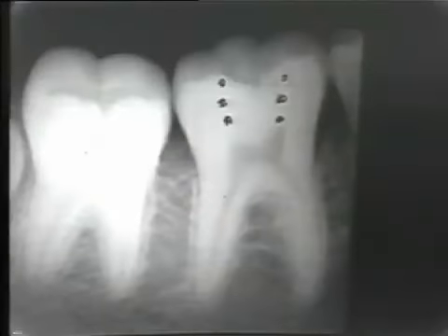Here's a radiograph in which the pulp has been somewhat accentuated and comes up to the occlusal surface. It's because many students have trouble visualizing in a mesiodistal direction the dimensions of the pulp. So study the pulp, study the radiograph, note that the pulp on the mesial comes about halfway between the central pit and the marginal ridge, and on the distal, the pulp comes to about the distal pit.